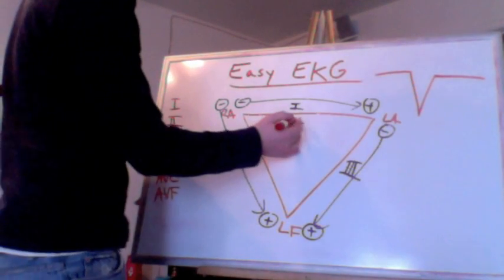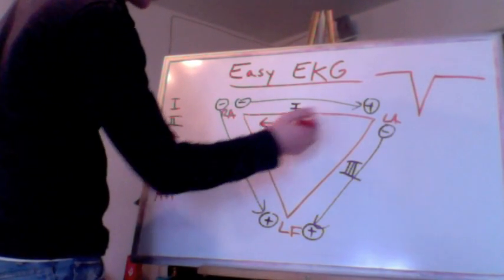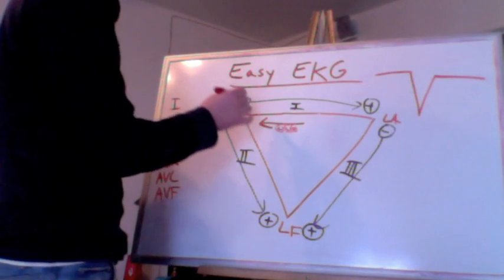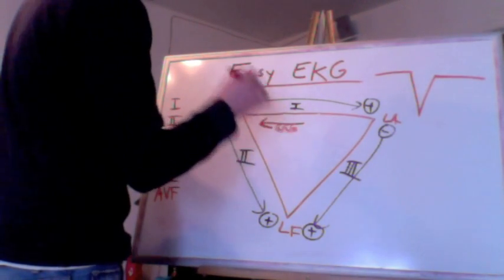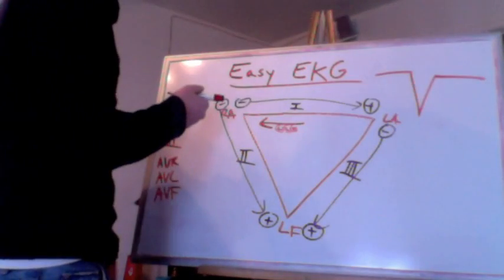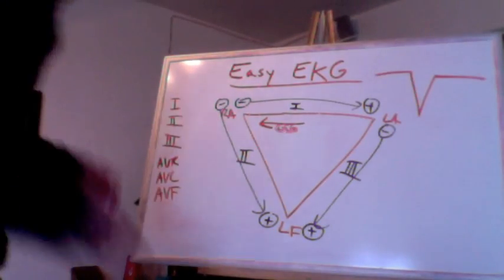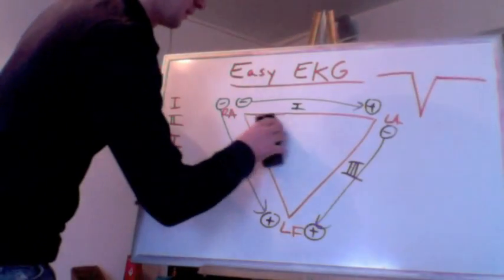It's going to be huge, right? Because our direction is going towards our positive charges are going towards the negative charge. He doesn't like to have those, so he's going to be really ticked off because you're having them go straight to him. Okay? They're not taking any detours. They're going straight to that negative electrode, and he doesn't like that. All right? So now what happens if we switch leads?